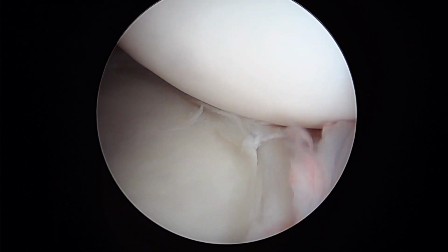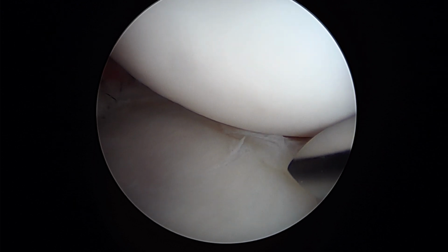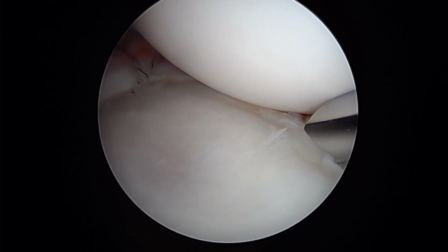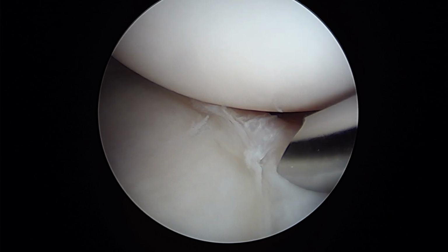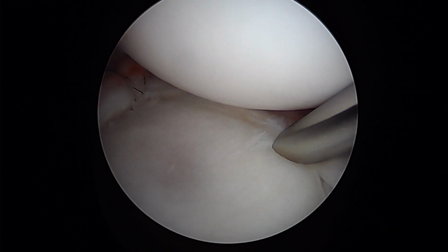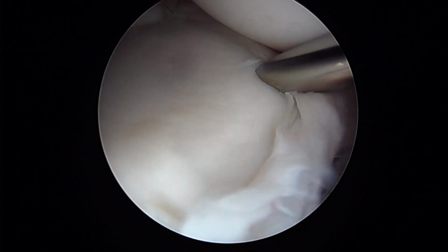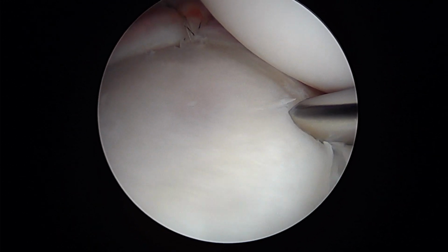I'm now going to take my guide and find a spot. Lift up on the arm just a little bit straight up, or pull back towards you just a little bit. It's just easy, yeah. So 6 o'clock is right there. We're going to place this down. Maybe a shade lower. You have a real petite shoulder, obviously, so we're going to get one right there, I think. Hold the camera there with the right hand. We'll show you some more in a little bit.